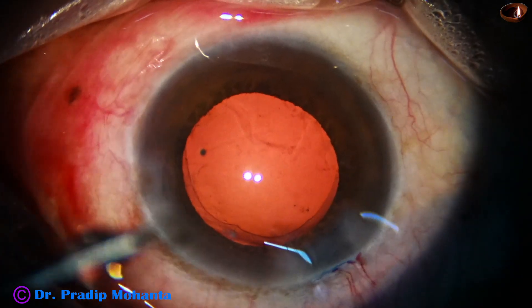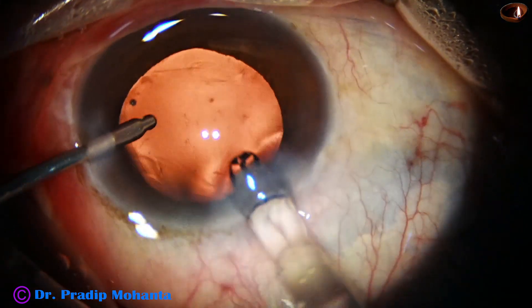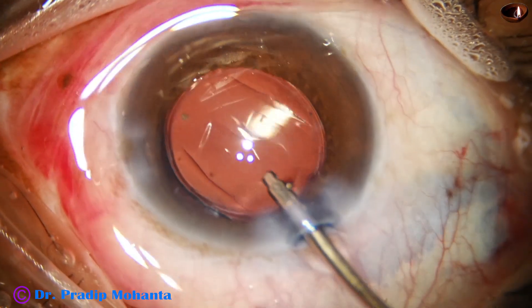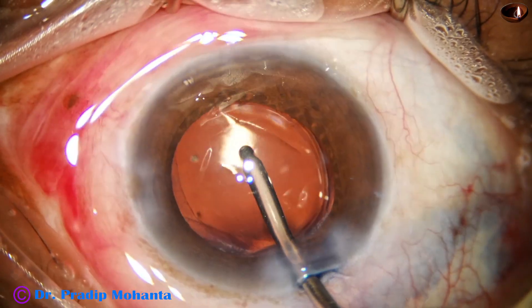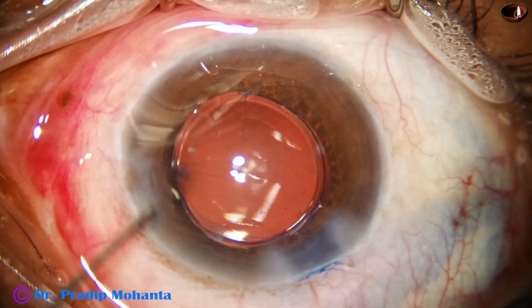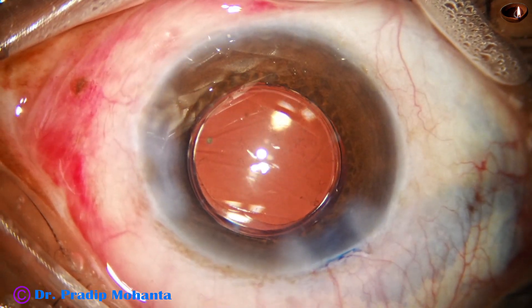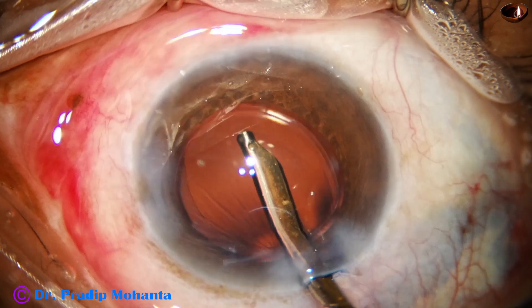And now is the time to implant an intraocular lens. I am going to do hydro-implantation of this single-piece monofocal intraocular lens. The lens has gone into the capsular bag. Whether the lens is in the bag or not, we can rotate and check in those areas where the anterior capsular rim is visible. This is a bit of moxifloxacin. And now the side port is closed by corneal stromal hydration. Then this is a final lavage of the anterior chamber.